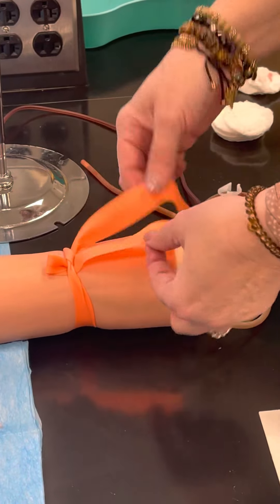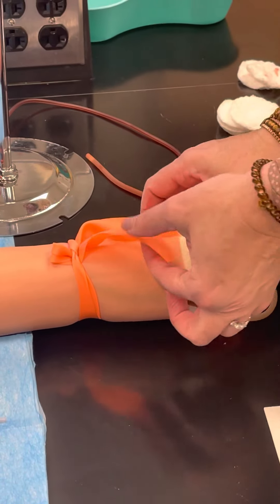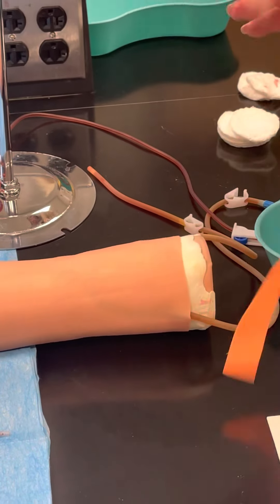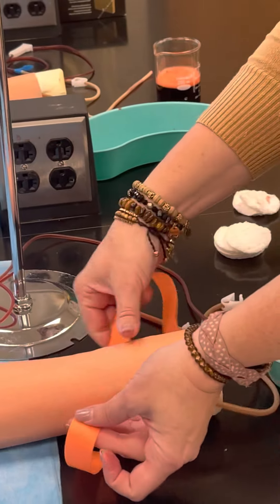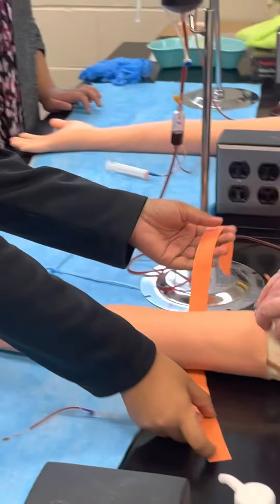This strategy keeps the tails out of the way of where you're gonna draw blood and it allows you to do a quick release by just pulling on one string. Now I want you guys to practice tying — one of you is gonna hold the arm and the other one's gonna tie.